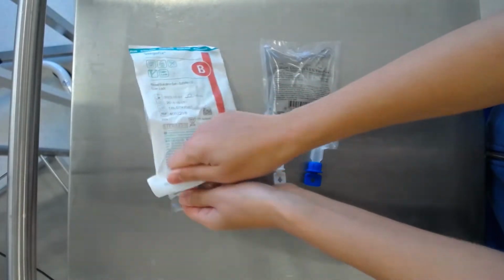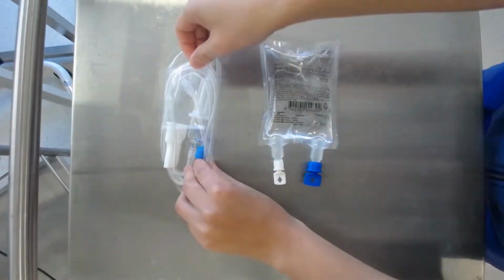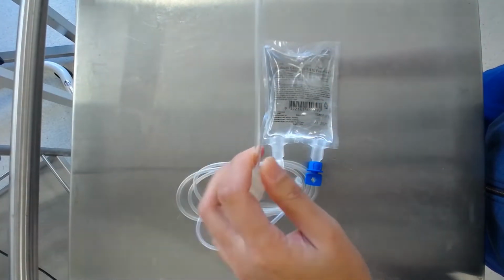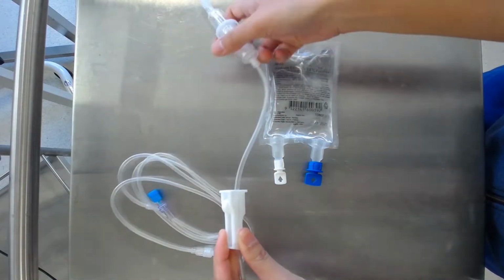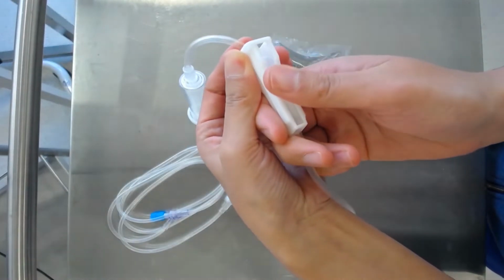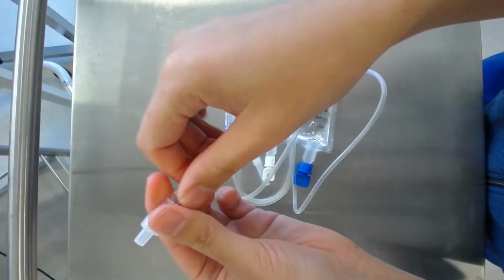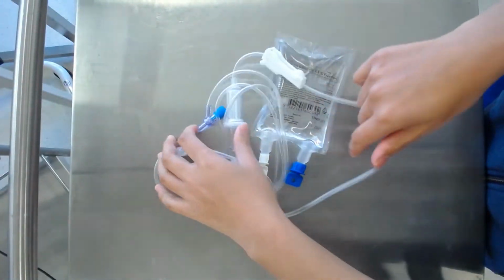So now that we've added the medication to the bag, we can now open the infusion set, maintaining sterility of both ends of the tubing. Place the roller clamp about 2 to 5 centimeters below the drip chamber and move the roller clamp to the off position. Close proximity of the roller clamp to the drip chamber allows more accurate regulation of flow rate. Moving the clamp to the off position prevents accidental spillage of fluid and decreases the amount of air bubbles when priming the line.